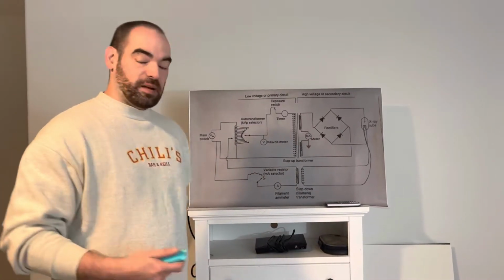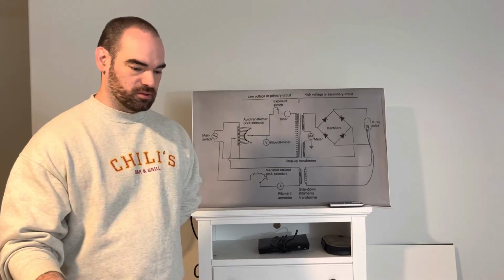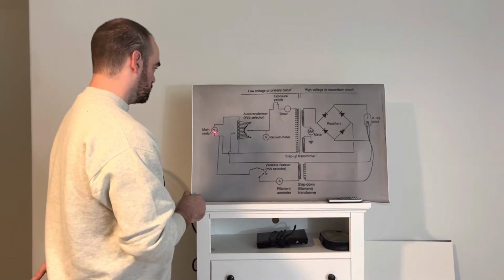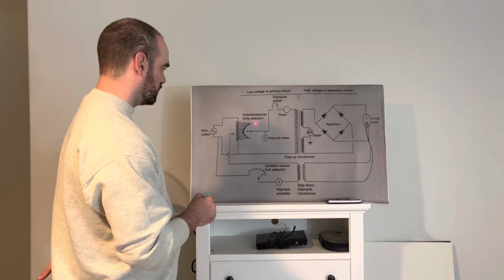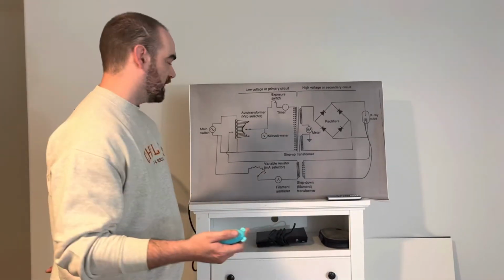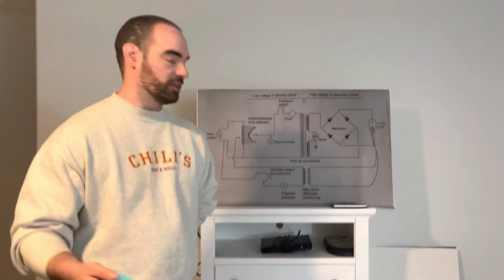Now, once power is turned on, that 220 volts will become 110 volts and 60 hertz going through the circuit. Line number 1 and 2 will meet up at the auto transformer. This is where the technologist will select the kVp. We'll say we'll have a kilovoltage of 120.